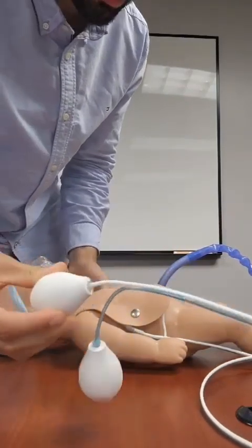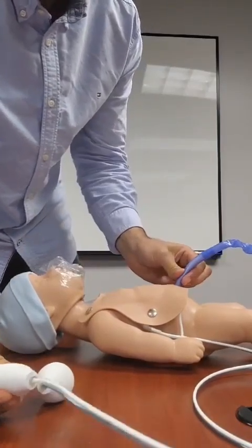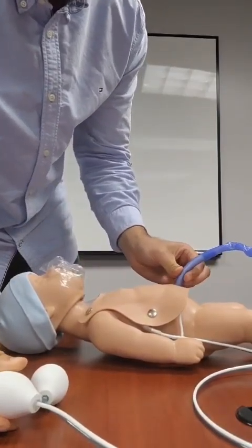So the white tube is used to simulate heartbeat, which you can feel right here, as well as in the umbilical cord pulse.